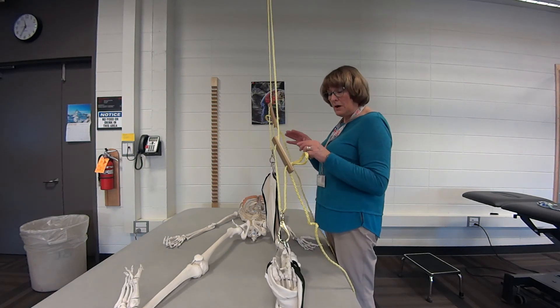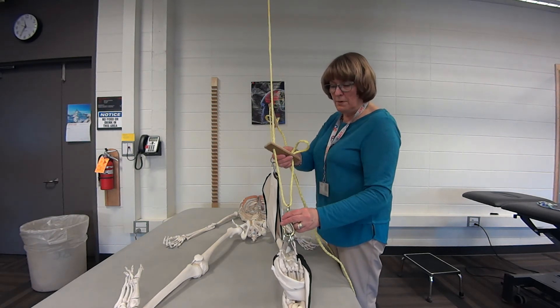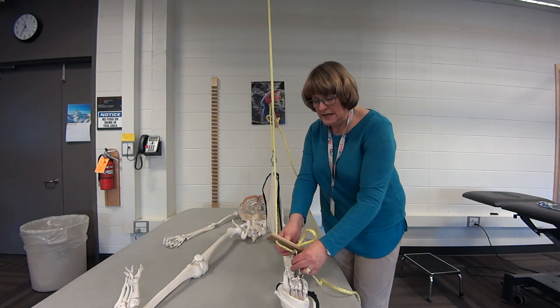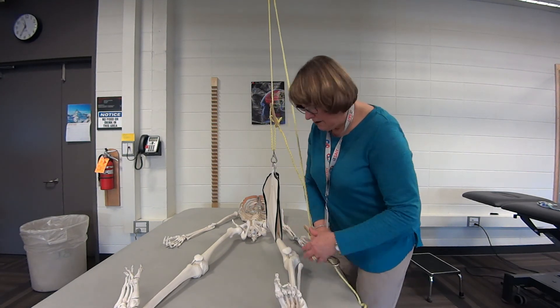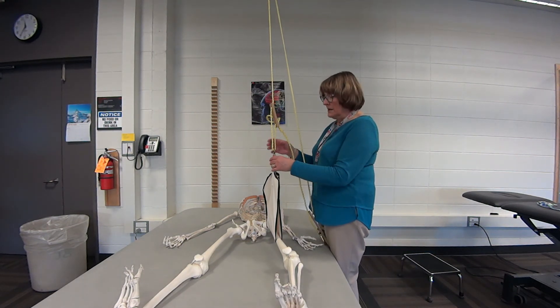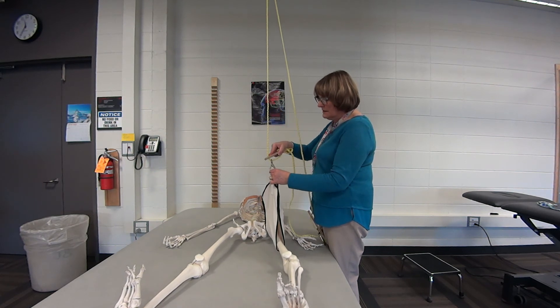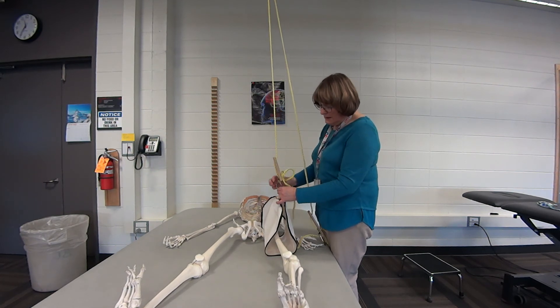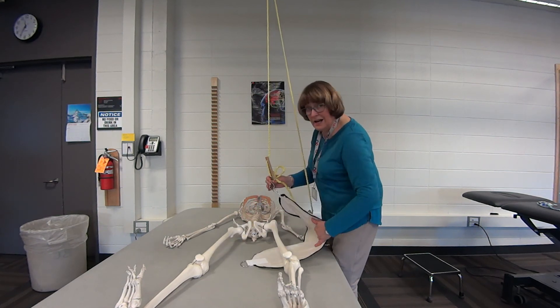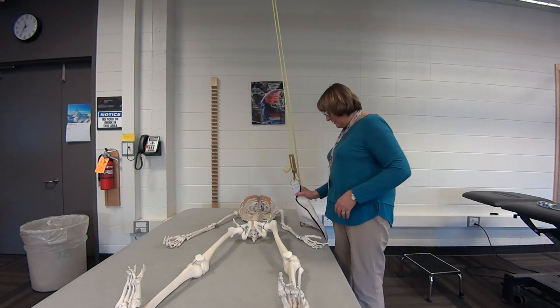When you put them down, put down the most distal part first because you don't want hyperextension of the elbow or the knee. Then come up to the thigh, lower it down, unhook it so you can slide it out from underneath their thigh, and move it out of the way.